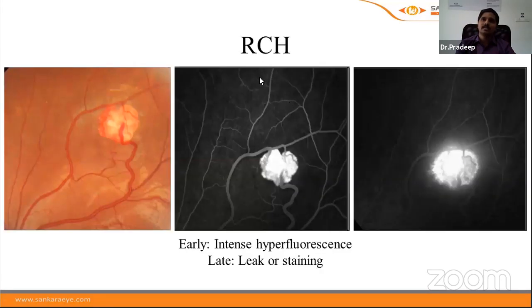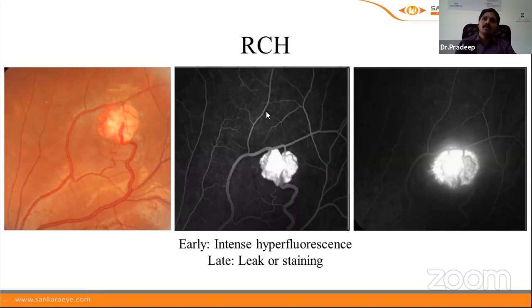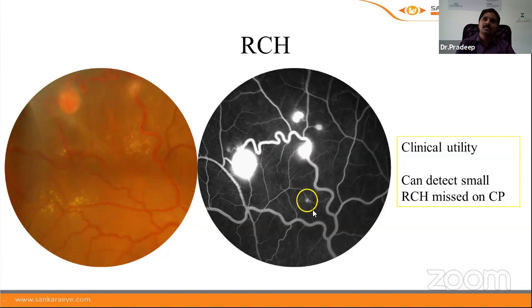Retinal capillary hemangioblastoma, commonly seen in Von Hippel-Lindau disease, shows intense hyperfluorescence in the early phase — being composed entirely of blood vessels — with leak or staining in the late stage. A key clinical utility of FFA in VHL is identifying smaller lesions missed on color photograph. If one or two lesions are visible, FFA should be performed to find additional smaller lesions, which should be lasered at an earlier stage before they enlarge.